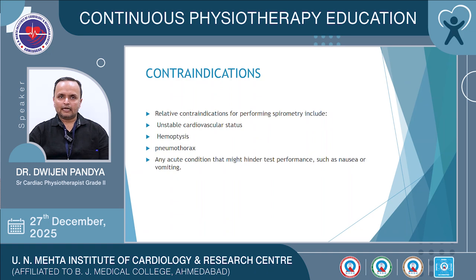To speak about the contraindications, there are no real contraindications for a PFT test, but the relative contraindications for performing spirometry include unstable cardiovascular status, hemoptysis, which is the presence of blood in the sputum, pneumothorax, that is the presence of air in the pleural cavity, and any other acute condition that might hinder the test performance, such as nausea or vomiting. So these are the relative contraindications for the PFT test.